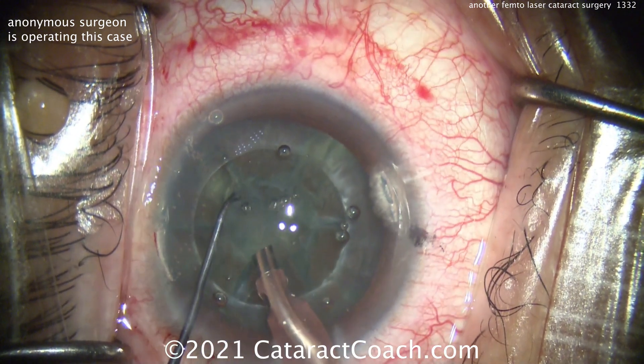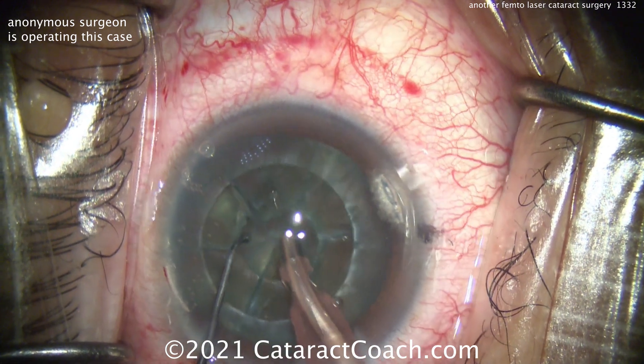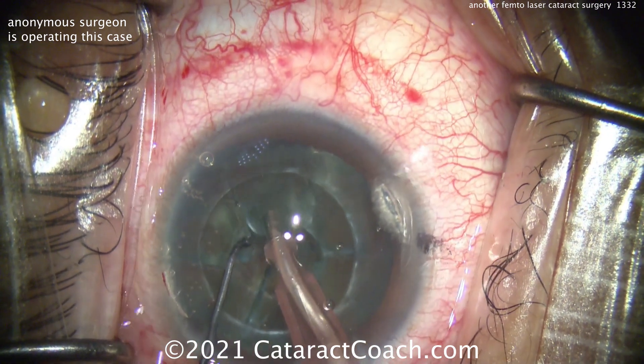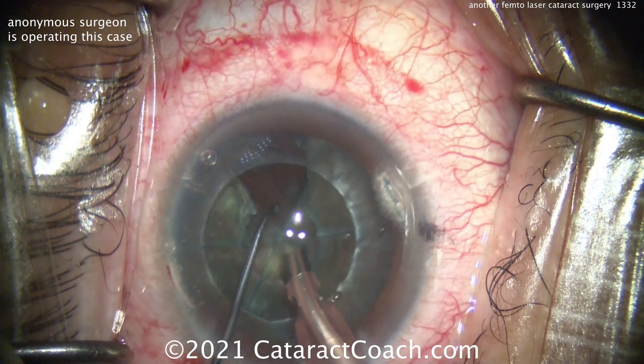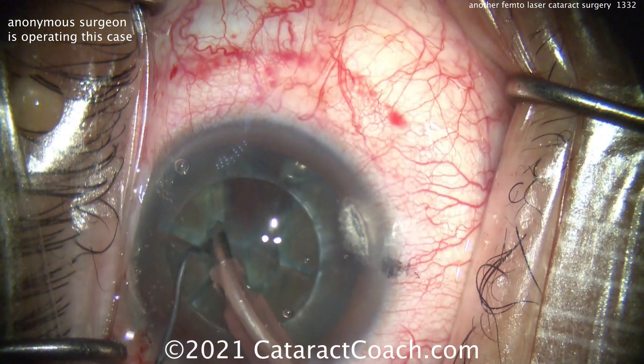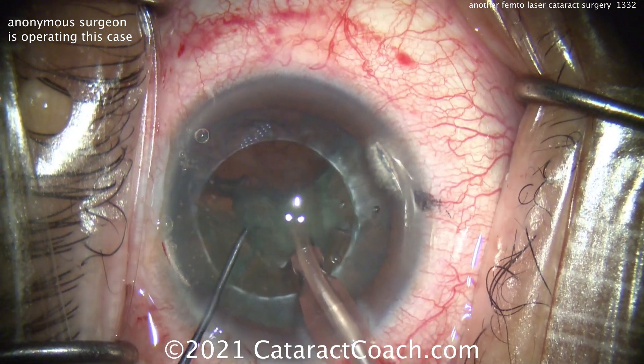And again, a little bit more of a split. Remember, these lines that were created — these sextants that were created — aren't fully separated. They don't go all the way to the periphery and all the way to the posterior capsule. So they're through most parts, and you may still have to put in some effort here to separate those pieces.